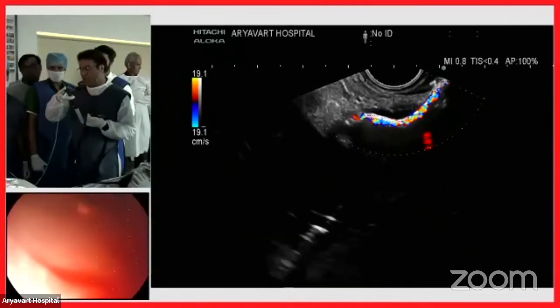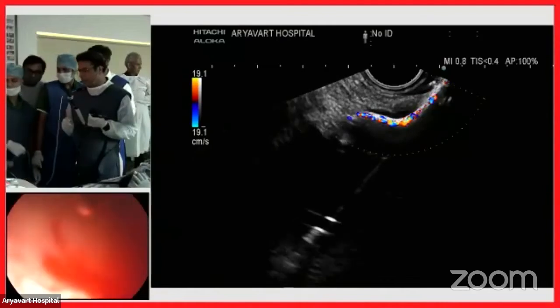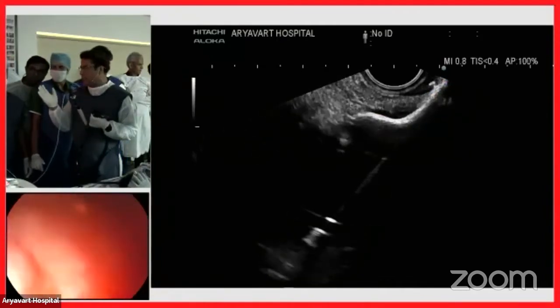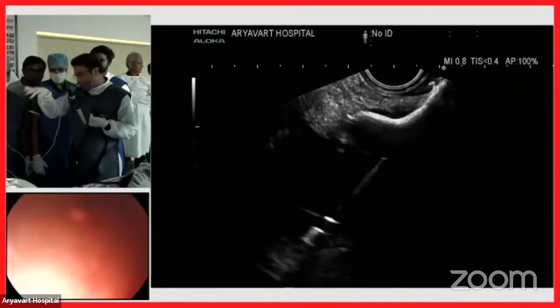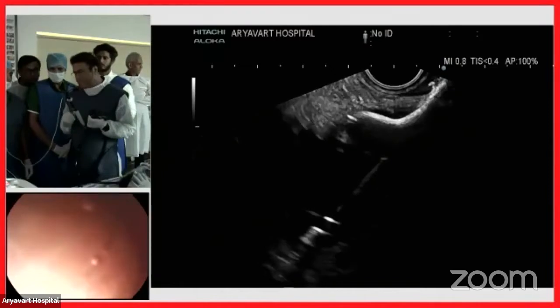And now can you see the flare? Yes, we can see it. Doppler, please. Nicely done. Now you can see we are just seeing an arm of the flare, the other part is being shadowed, but that's okay. So next is the third step.